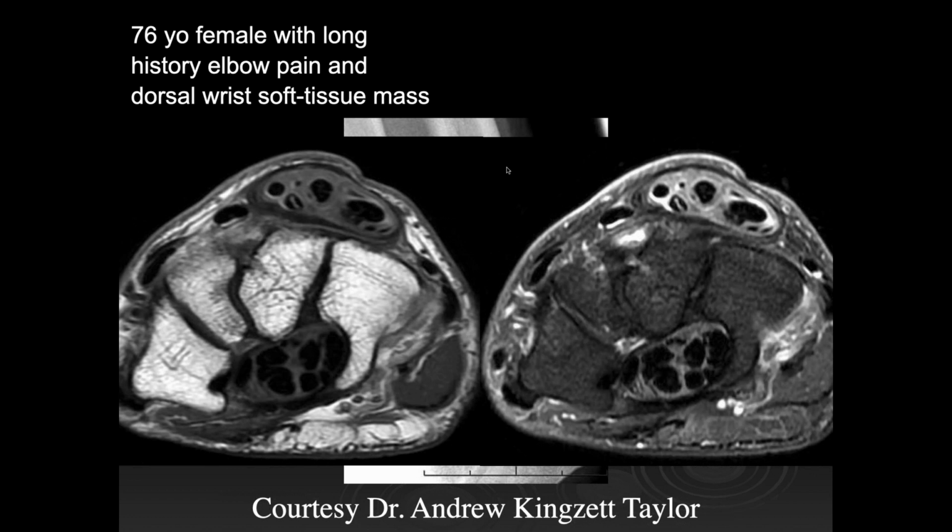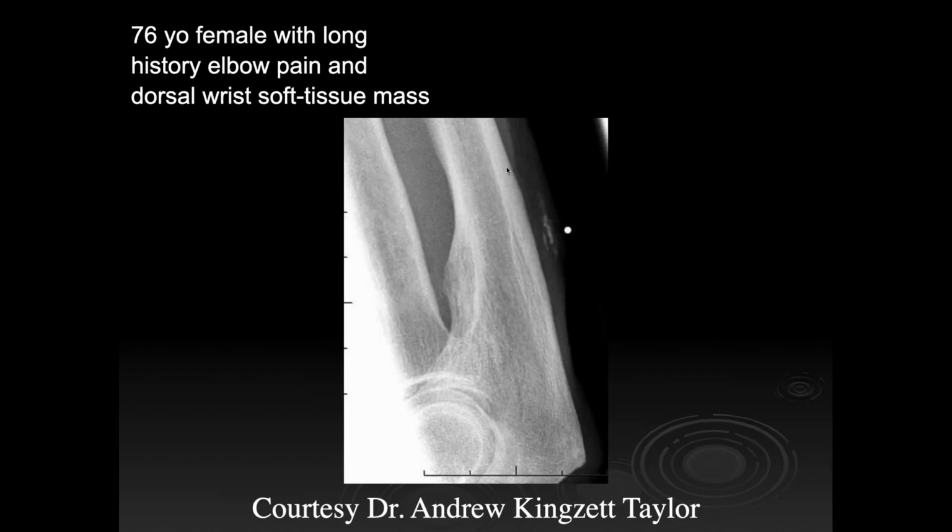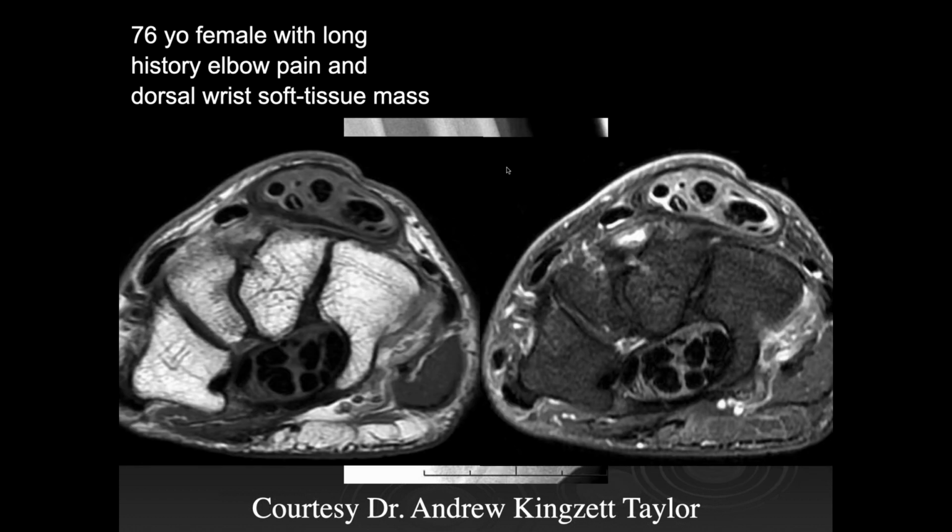There's a lot of tenosynovitis and synovitis, some increased signal throughout that extensor compartment, some increased signal along the extensors and some synovitis, maybe even split tearing. So what are you going on here? You have the, hold on, this is like a scleroderma. Good.